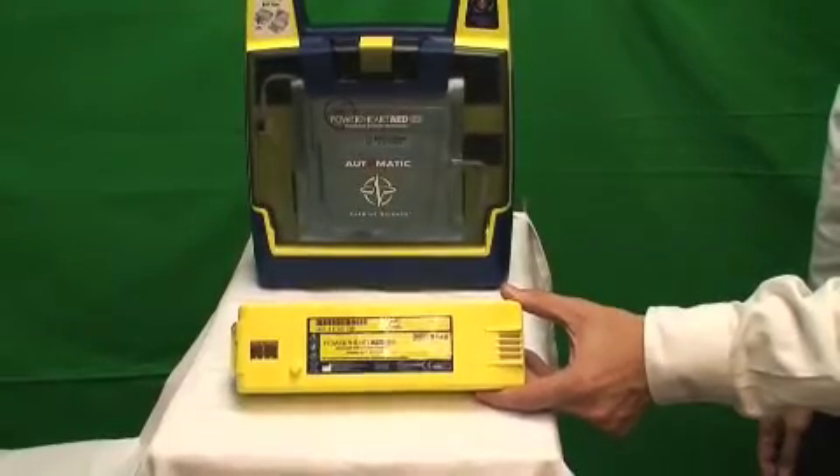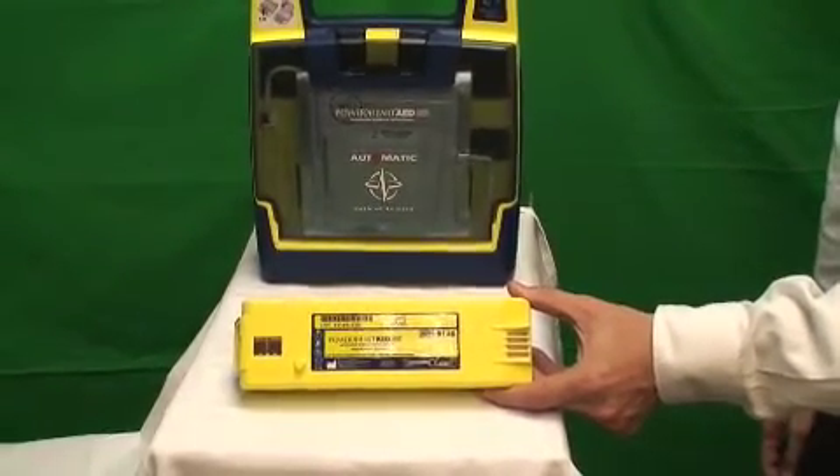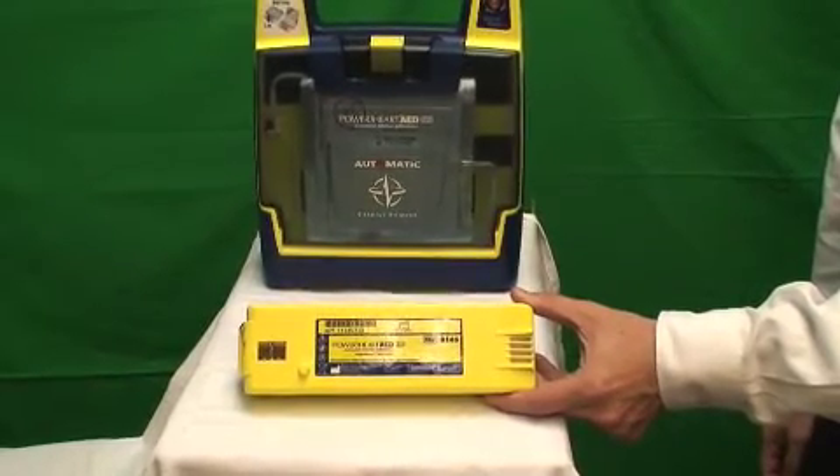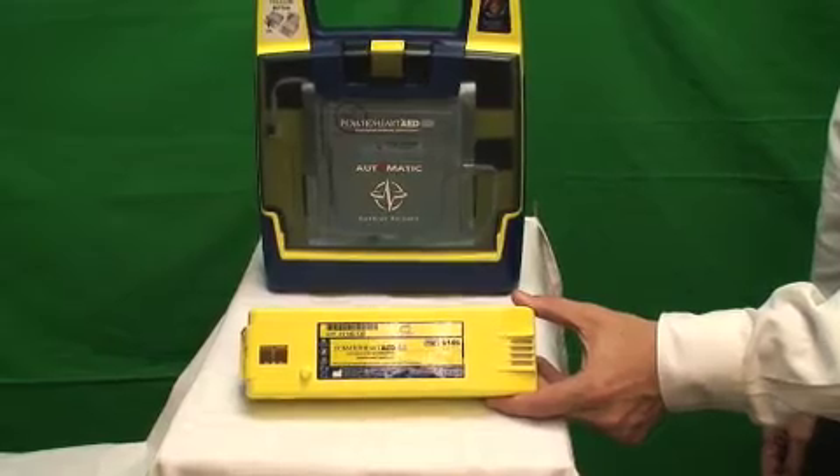The G3 Plus runs on a full lithium battery, which is non-rechargeable. The lithium battery is guaranteed to last for four years and is one of the strongest batteries in the industry.